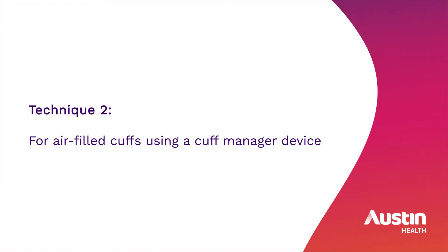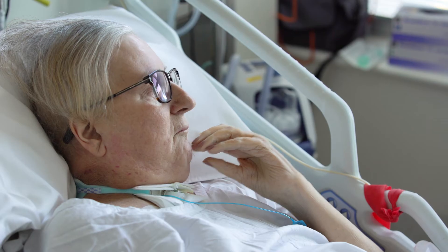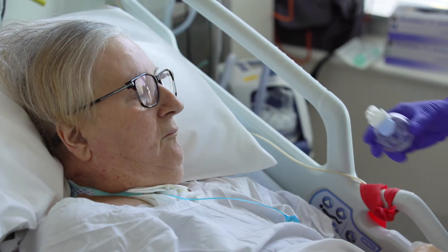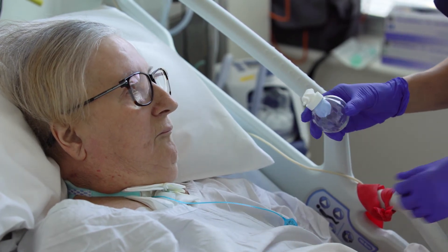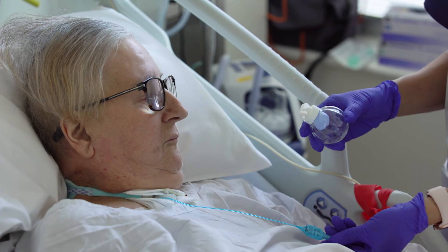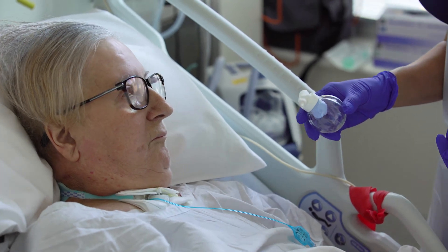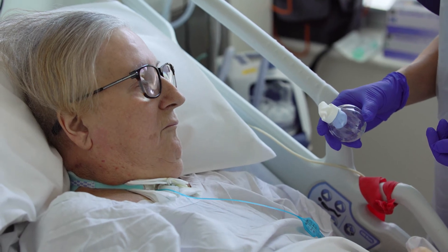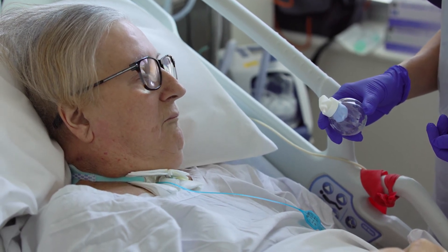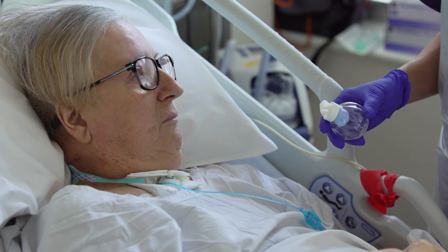Technique 2 for air-filled cuffs using a cuff manager device. Cuff manager devices can be used with patients who have a suspected cuff leak. This device allows air flow between the tracheostomy cuff and balloon chamber which continually maintains the internal cuff pressure. There is no need to use a manometer to check cuff pressure when this device is in place.